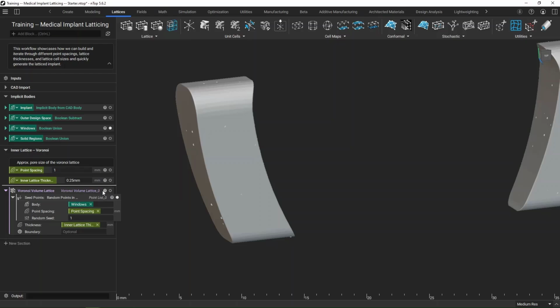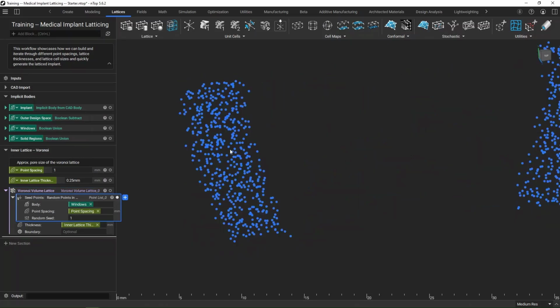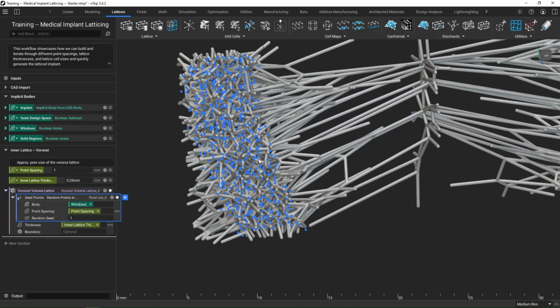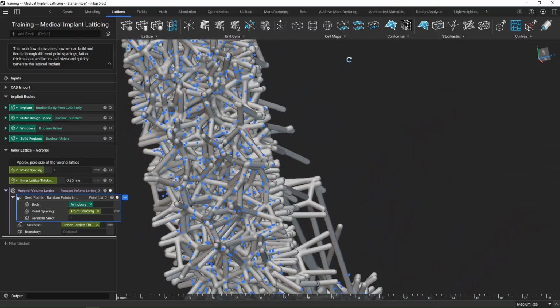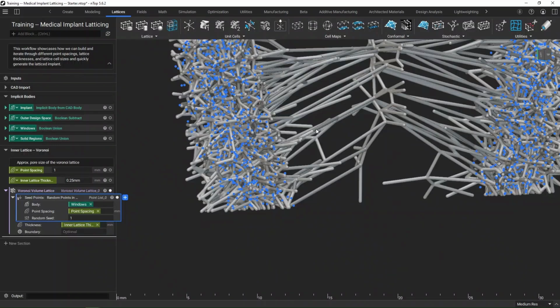And so now that that blue question mark has turned gray, we know that it's run. So I'm going to hit this block, hit I to isolate the view. And that lattice might not look exactly like what we're going for, right? Because basically it's taking in the list of points, which is kind of two different clusters of points, and it's creating that volume lattice around those points, as you can see if I pan around here. But we've got some stuff in the middle. Maybe we want to clean that up. We also want to close up that volume too.